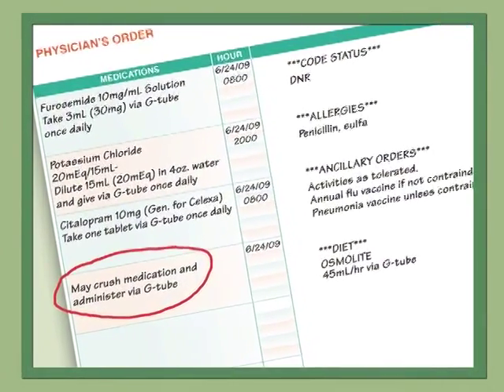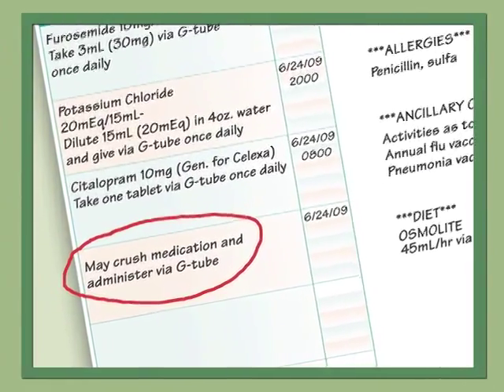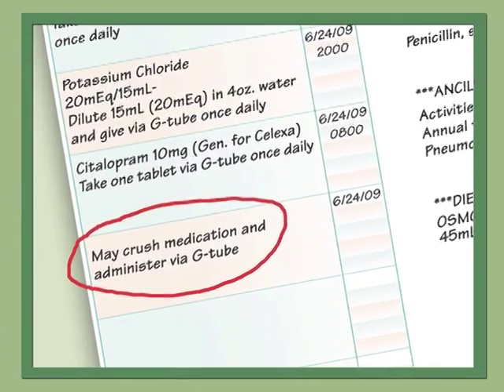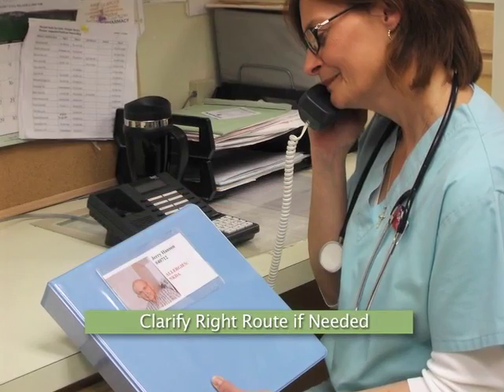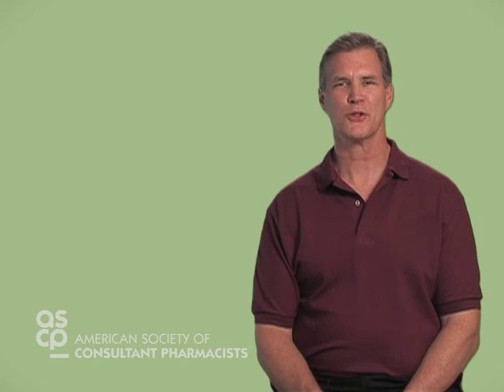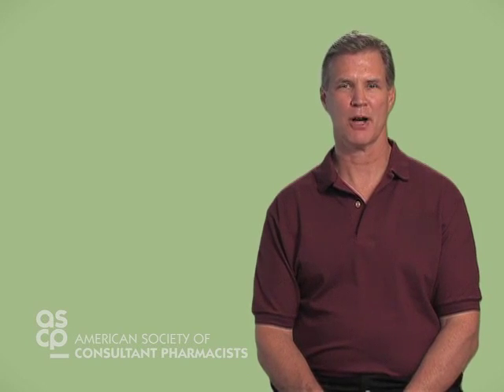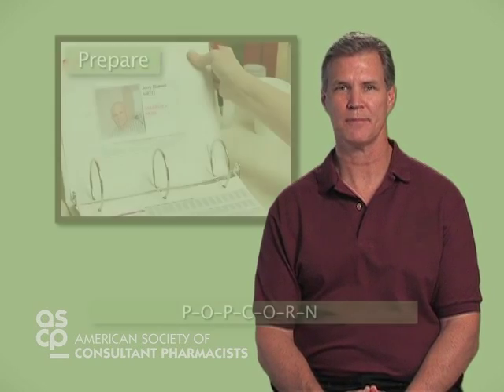Prior to the administration of any medication through the G-tube, the nurse must be certain the order specifically states the G-tube as the right route. If the doctor's order does not specify a route, a clarification will be needed. Once certain the G-tube is the ordered route, our nurse can remember the sequence of administering medications by way of a G-tube with the acronym POPCORN.